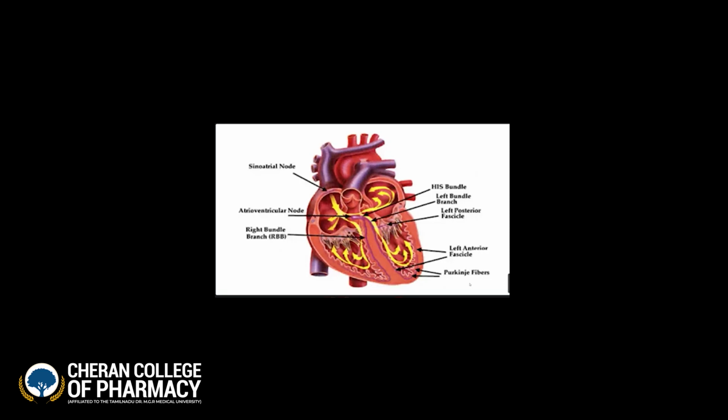After that, the impulse travels towards the ventricle. The remaining waves are the QRS segment. During that time, the impulse is at the ventricles, both the right and the left, so QRS waves are generated. When the impulse is moving away from the ventricle, the relaxation phase is coming. We also say this is the phase of repolarization. During that time, the ventricles are relaxed, so the ST segment and T waves are generated.